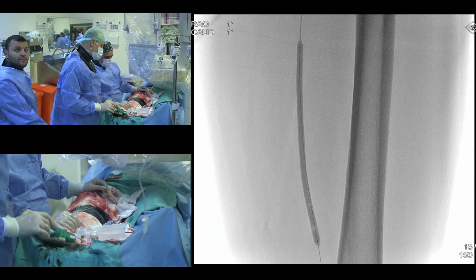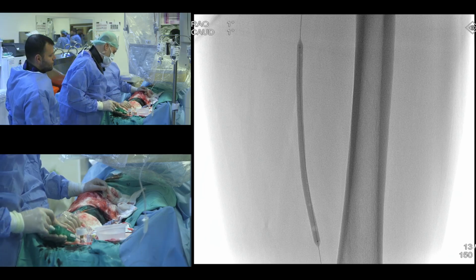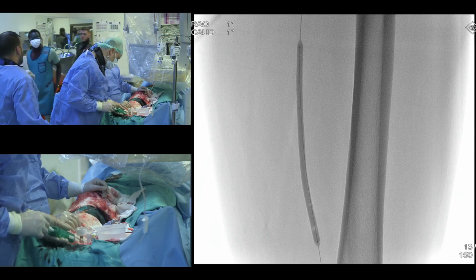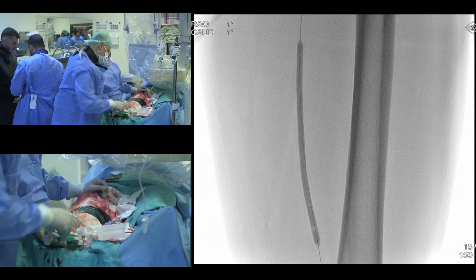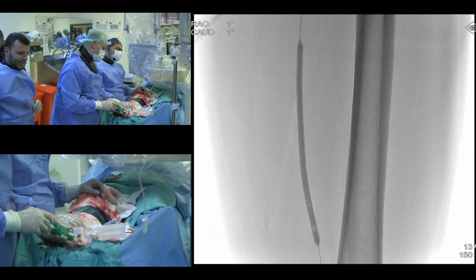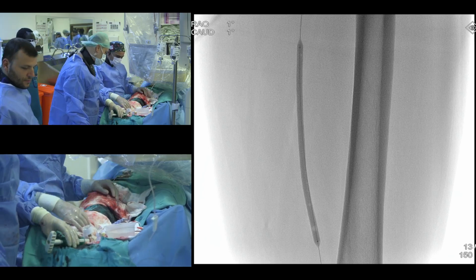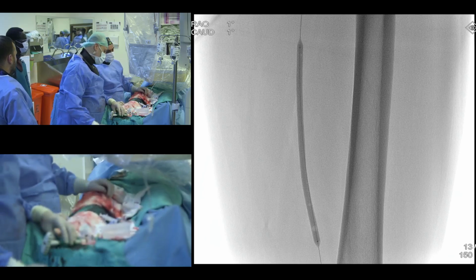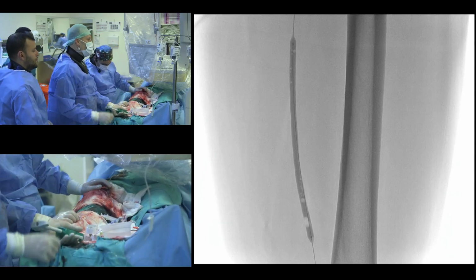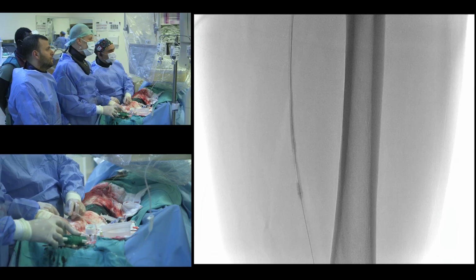Ersan, how much minutes do you inflate the balloon? 1 minute. At least 1 minute, but without drug eluting. Drug eluting balloon with at 3 months, 3 minutes. Yes, yes. I inflate all type balloons for 3 minutes, regardless of drug eluting balloon.